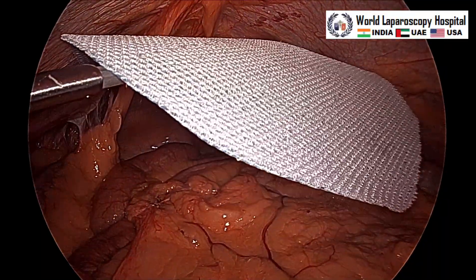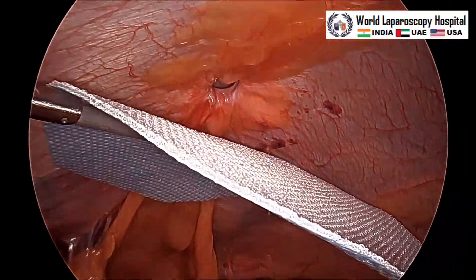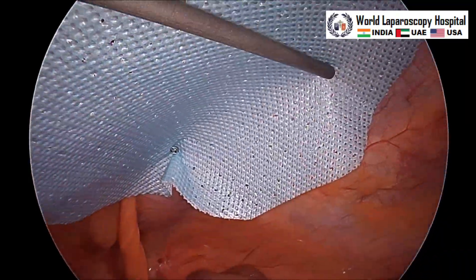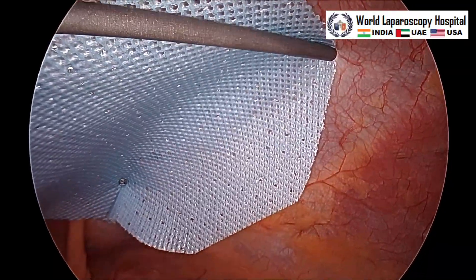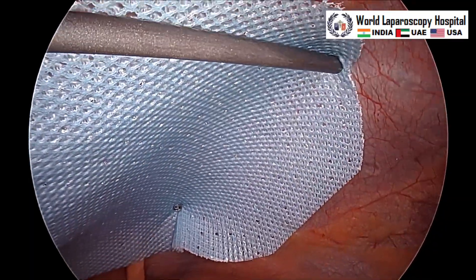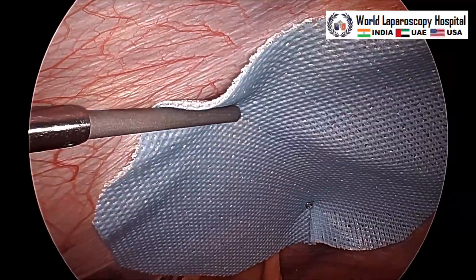Because we do not have another instrument, with the tacker itself you have to lift the mesh. The light cable should be at 6 o'clock and you will just drag it to the point where you have marked it. Fire the right iliac fossa part first — that is the most remote part — then towards the right hypochondrium, and all the corners should be fixed first. The left hand should support it so that you have proper alignment, and the center of the mesh must be in the center of the defect. That is why we have done the marking outside.